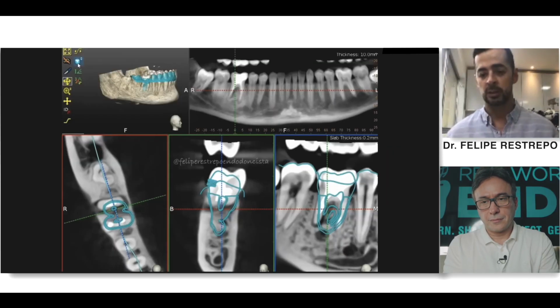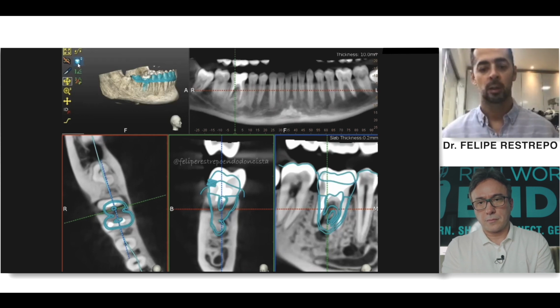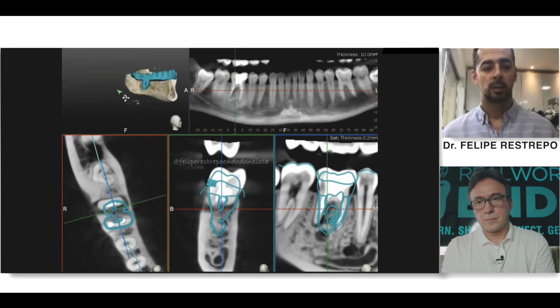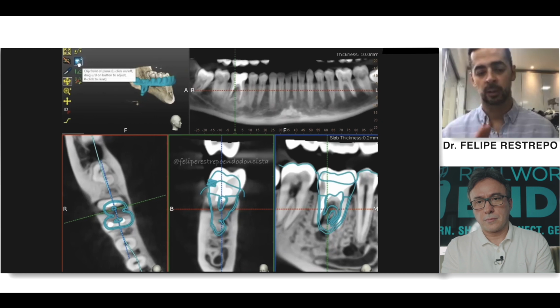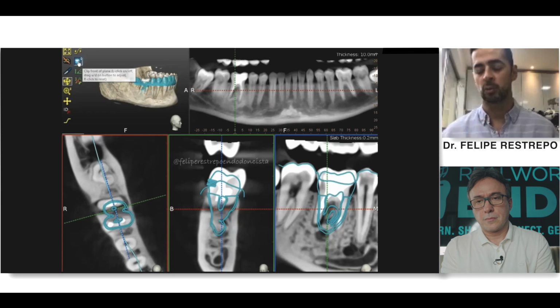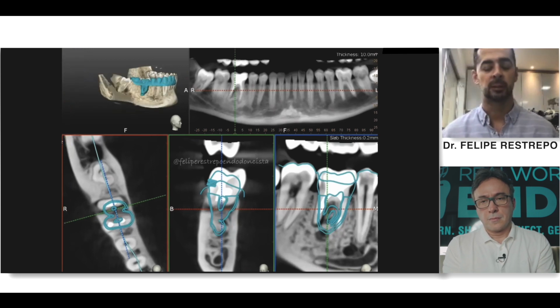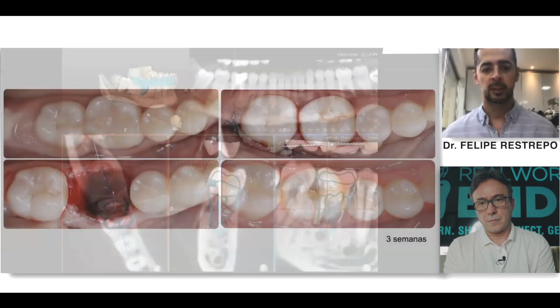We have this green silhouette of the transplanted tooth that enables us to modify the socket three-dimensionally with a surgical burr. This is just so you can see the perfect match of the DICOM in the upper left with the STL. You see the perfect match between the two files. This is done automatically by the software on the Navident. So this is the clinical scenario.